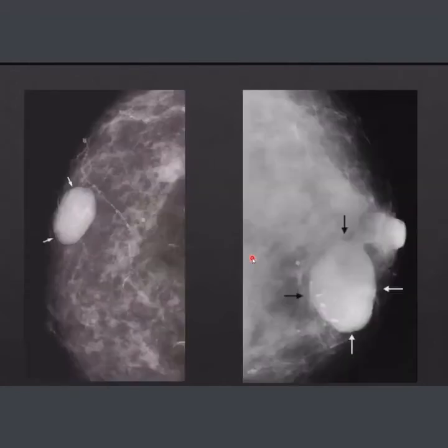Okay, but the benign masses on the other end tend to be spherical, well-defined, and may also contain calcifications, but the calcifications are different. They feel chunky and round and big, we call it a popcorn pattern. For example, this is a fibroadenoma of the breast, which is regular, circumscribed, with coarse chunky calcification, and this is also a circumscribed lesion that is benign.